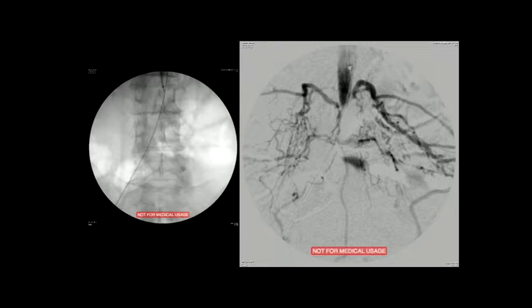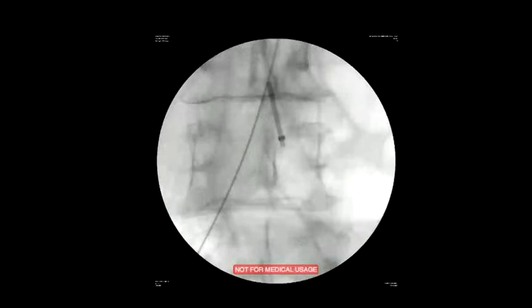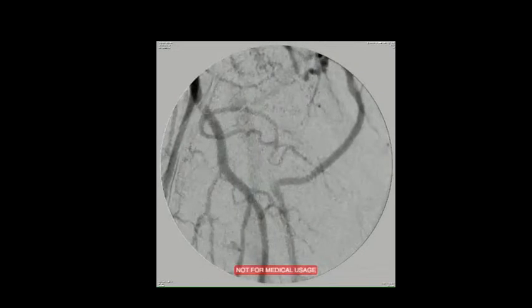we are going to address the left side, which we haven't yet crossed. We try from the top. We get in, but when we get close to the CFA on the left, which we have to enter to finish the procedure, we find that we're not able to get across. Now what? Puncture from below now.